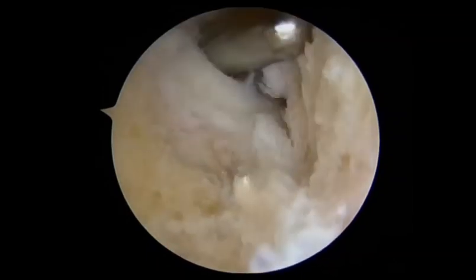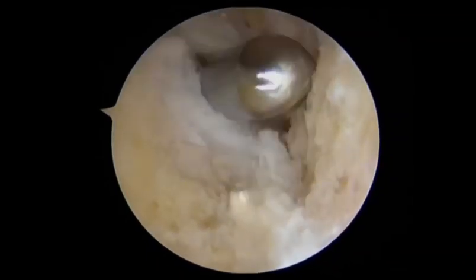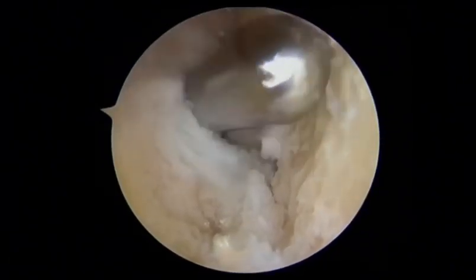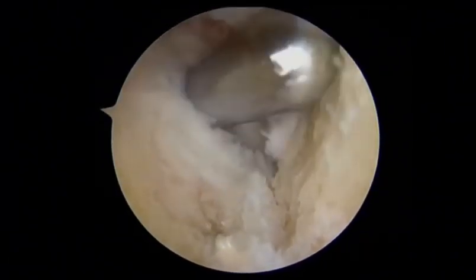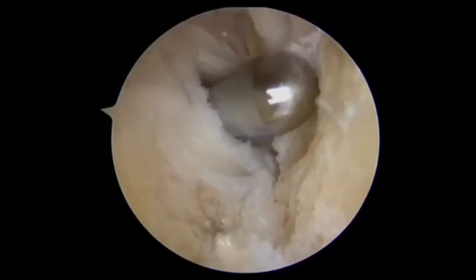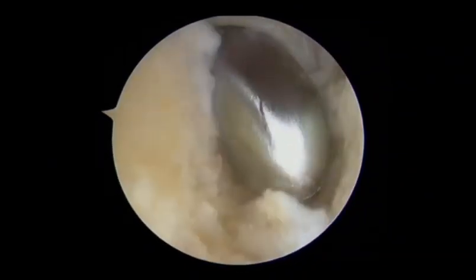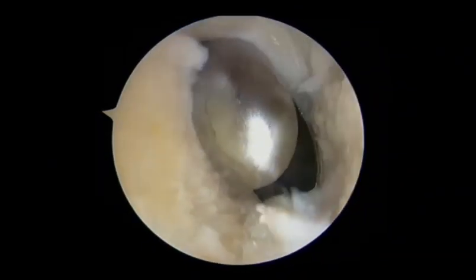The third step is to clean the tibial tubercle osteophyte. Since the tibial tubercle osteophyte is a three-dimensional structure, the shaver and the drill need to clean it from the proximal to the distal end and from the front to the back, using forceps to take a small amount of the tibial tubercle osteophyte as a pathologic sample.